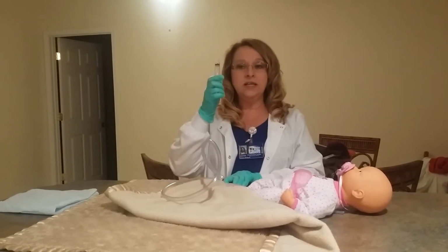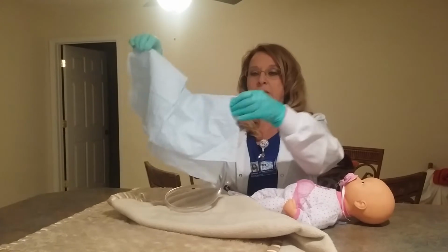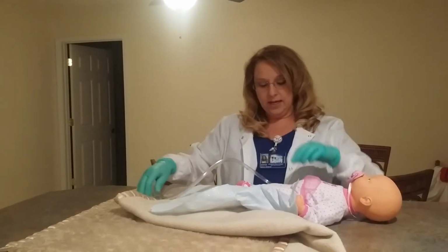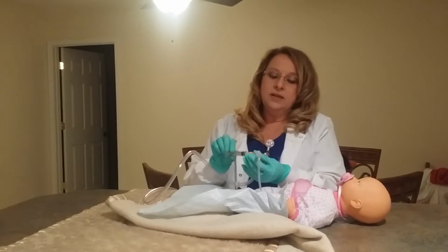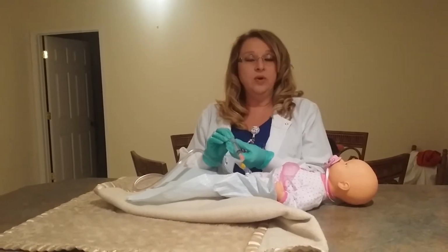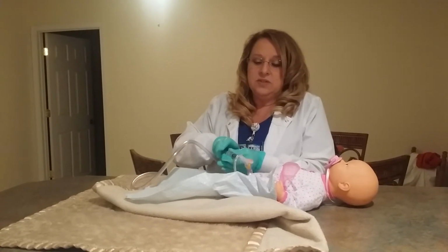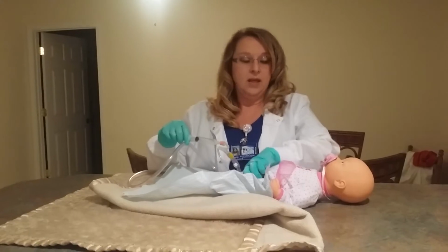Okay, now we take our 10 ml syringe after we place the pad under the patient in case there's any spillage of urine. Take your 10 ml syringe, hook it onto the luer lock mechanism of the Foley tubing, screw it on. We'll be withdrawing 10 mLs of fluid to deflate the balloon, as 10 mLs was necessary to inflate the balloon when the Foley was inserted.